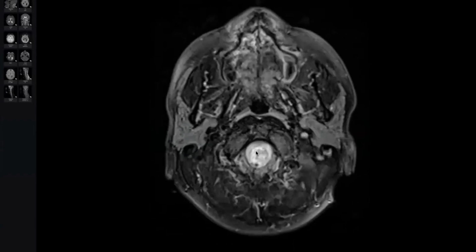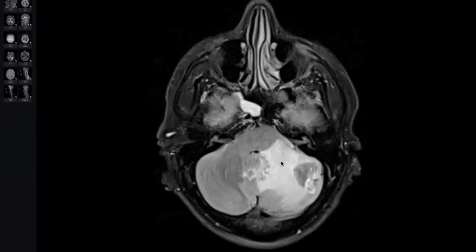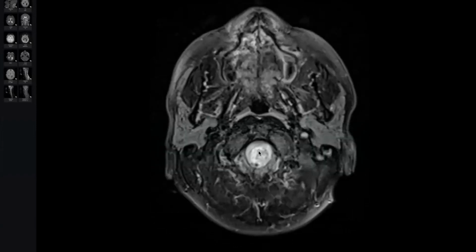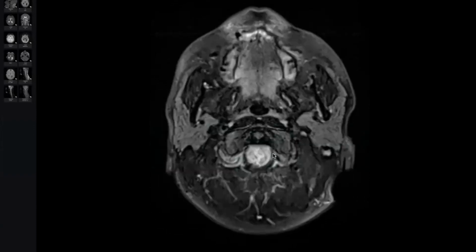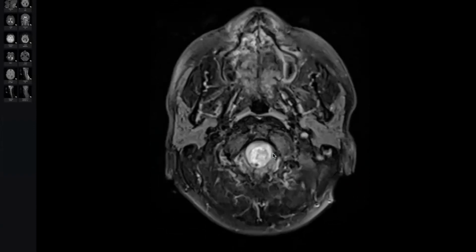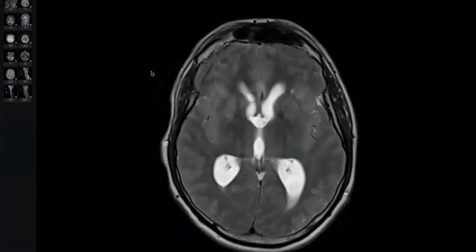The examiner will not give you marks if you talk only about the brain and don't mention the cord. Frankly, he brings cases like this to see if you have satisfaction of search or not. And at first he will give you something axial. Why make this mistake?